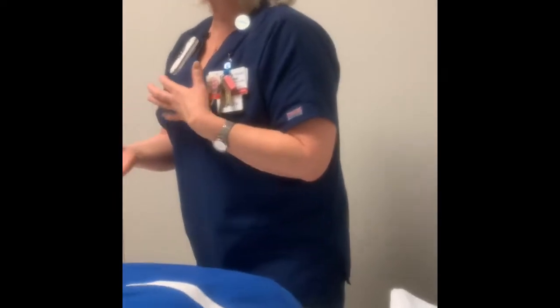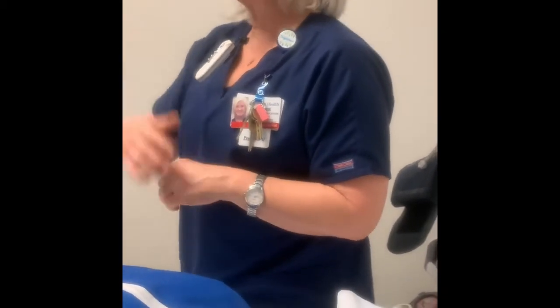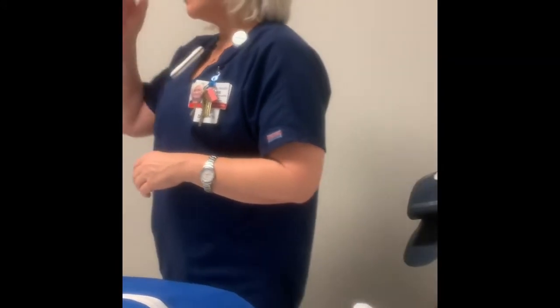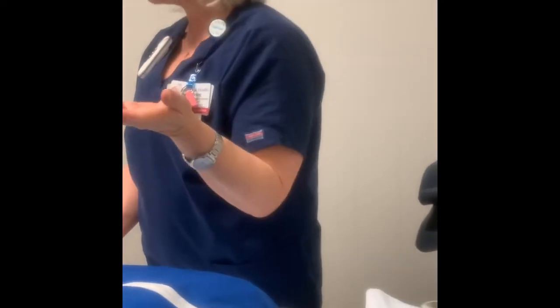And I always like to have them in because if I ever need to use it to ventilate them, it just provides more stability. But they don't always wear them. I've even seen them down here on the first floor when they're volunteers, walking around without their Larry tubes in. But it's an established hole. It's much like our pierced ears. You don't always have to wear an earring in it. It's not going to close up on you because it's all scarred in. So you don't always need it in.